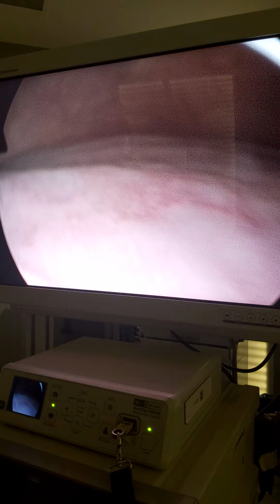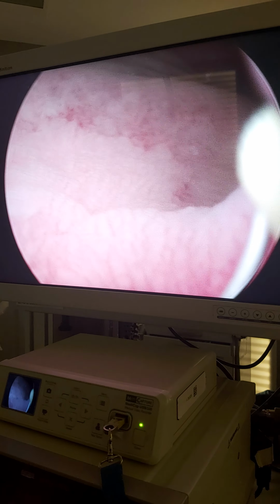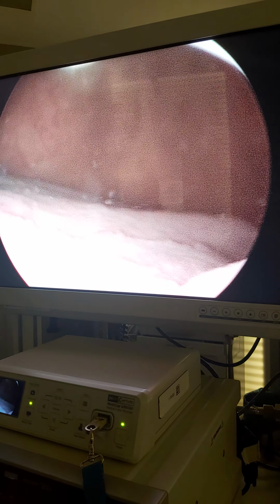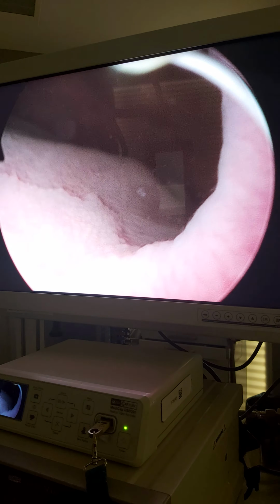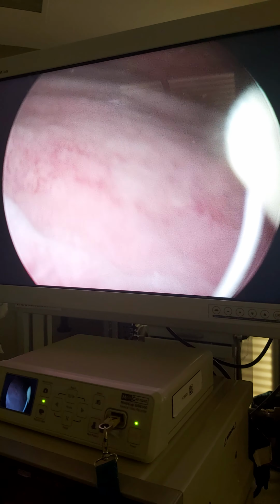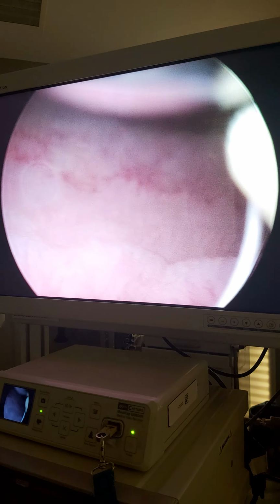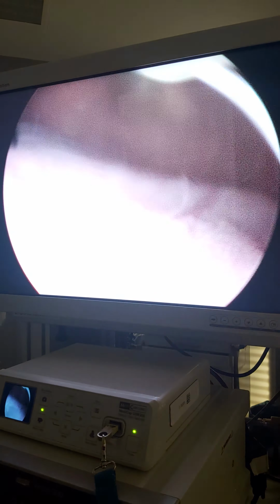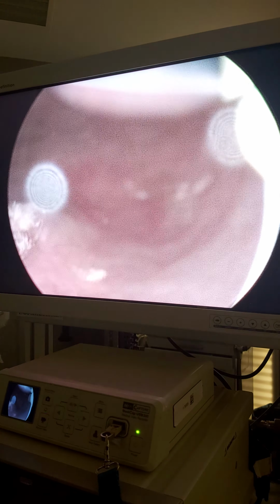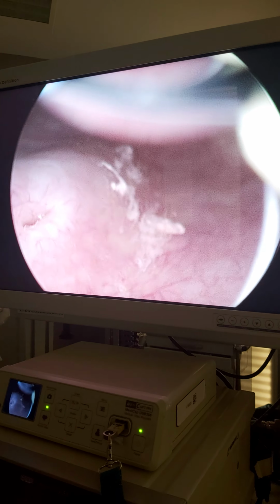Okay, here in this patient we are searching for leukoplakias, and we see white leukoplakias in ultrasound. Here also in cystoscopy I can differentiate these tissues. In the trigone she has white leukoplakia. The second portion of the bladder I look after the trigone, nowadays look at these infected particles. This is coming from the left kidney.